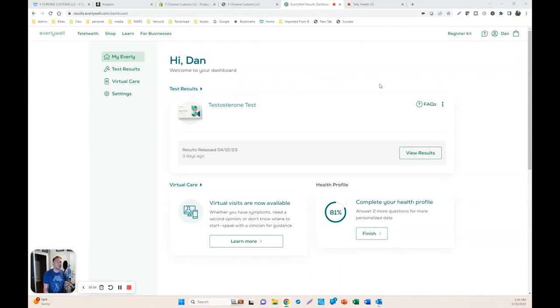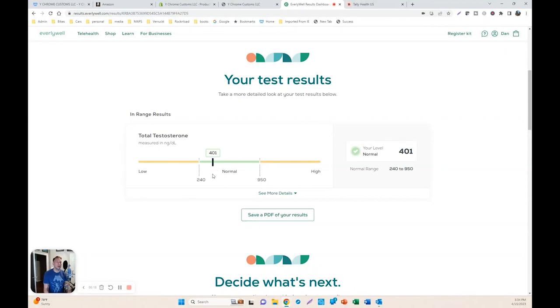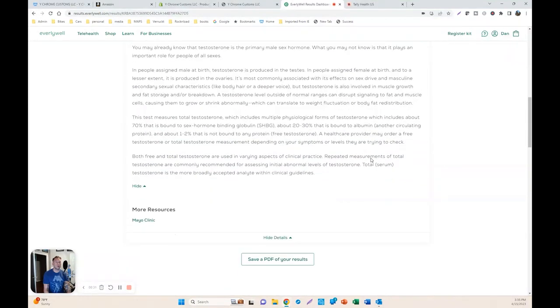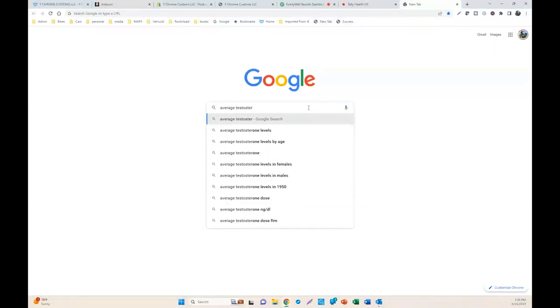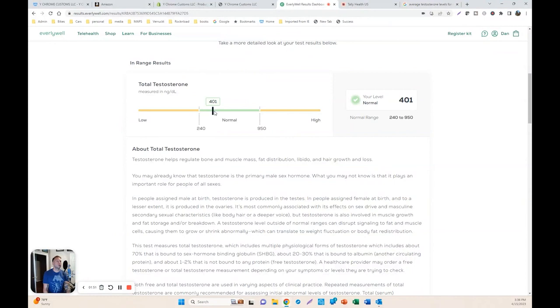I received the results of the testosterone test. Clicking over to review results, it shows that I was only at 401, which to me seems kind of low. It says that normal is 240 to 950. The app goes through more details about what testosterone does, but doesn't say much specific to my age. So I opened Google and searched average testosterone levels for males by age — here's a table showing total T from 252 to 916, and I am on the lower side of that range.